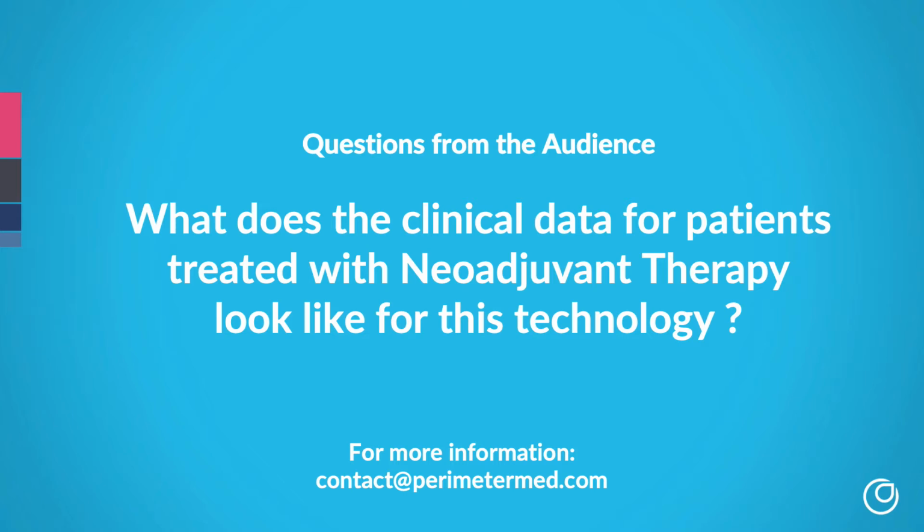So the ability to pick up that DCIS that has been left behind after the neoadjuvant therapy, the neoadjuvant chemotherapy particularly, I think is a very valuable tool in reassuring our patients that local recurrence in the breast conservation, the lumpectomy site, is going to be minimized, because if we find the DCIS at the margin after neoadjuvant therapy, we can do something about it intraoperatively.